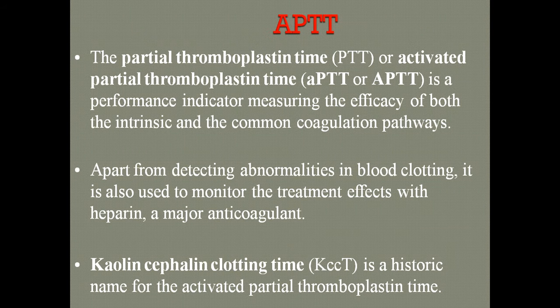Good morning, students. Today's topic is APTT, partial thromboplastin time, or activated partial thromboplastin time. This test measures the efficacy of both the intrinsic as well as the common pathway.